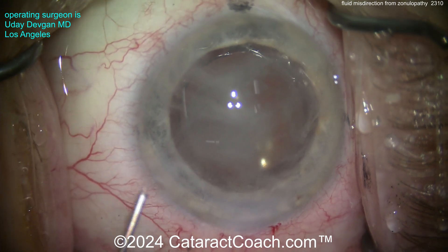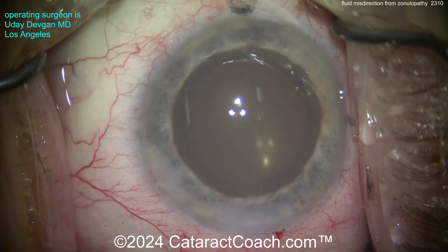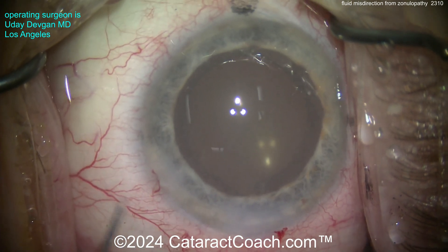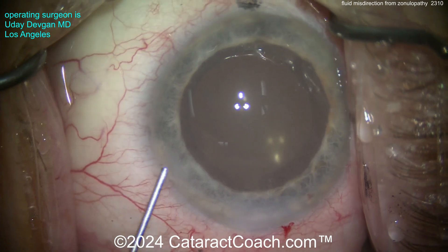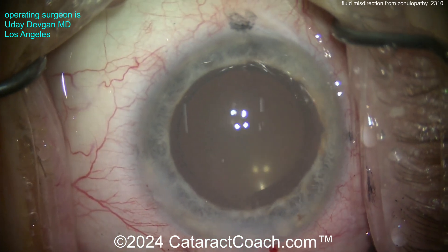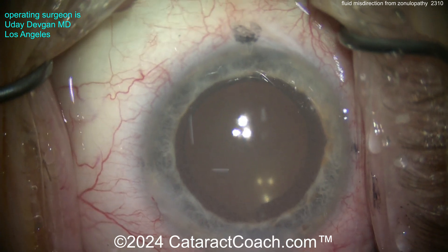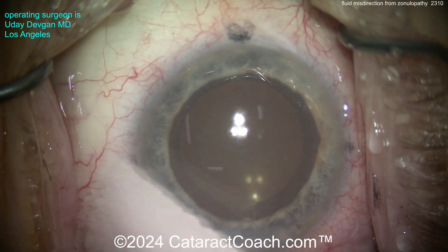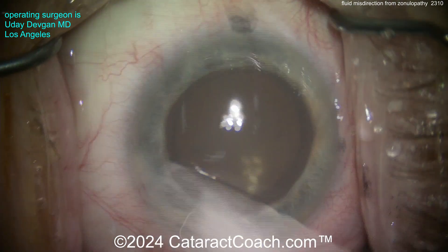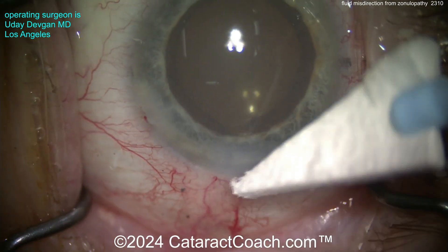There's no vitreous prolapse. Do you need a CTR? I don't think you do — I think the patient's going to be fine and have a really nice outcome. Watch the patient in the post-op period; if those pieces don't dissolve you could always go back and get them with a vitrectomy.